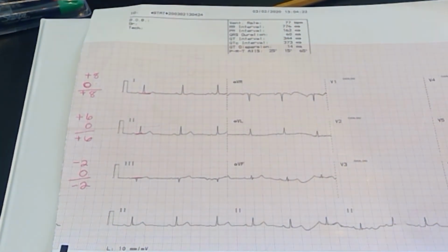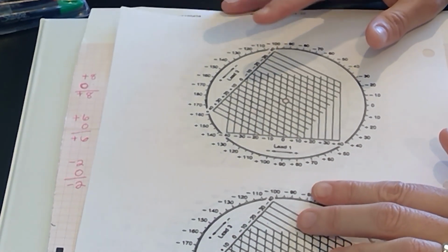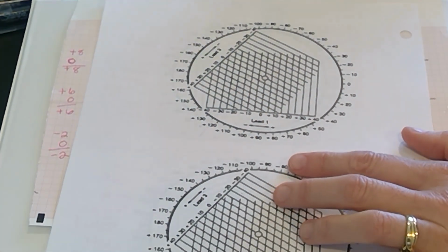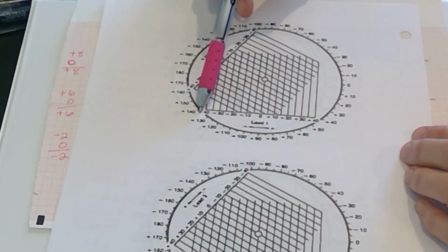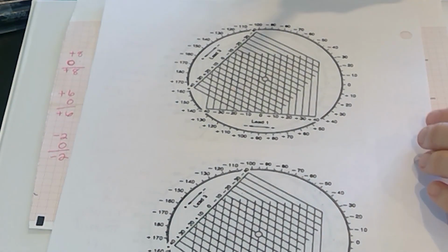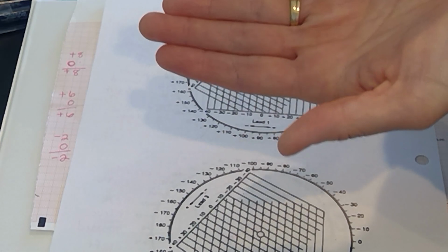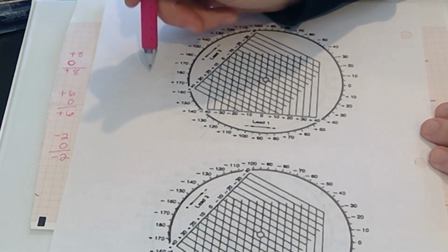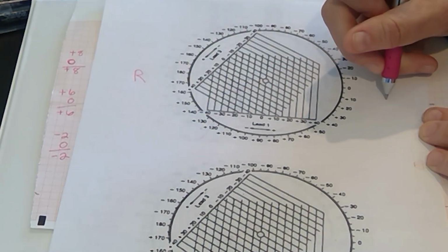Now moving on, how do we calculate, using those measurements, a person's MEA using the compass? Well, just to remind you, down here, this represents lead 1. It's negative on the person's right wrist and positive on their left wrist. This picture should represent your patient's heart looking up at you. So it's their right and it's their left.